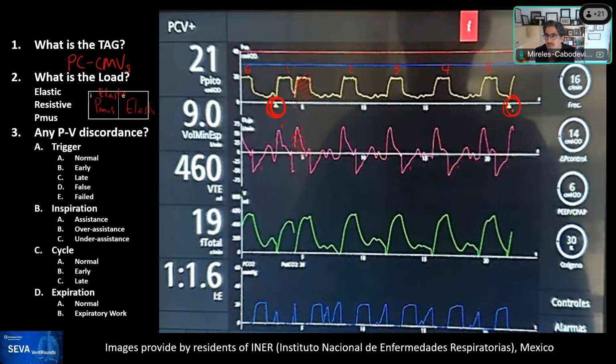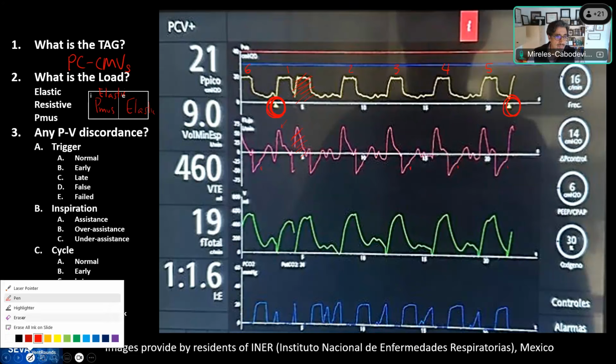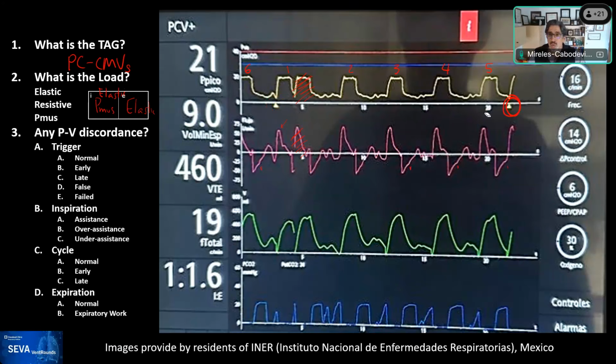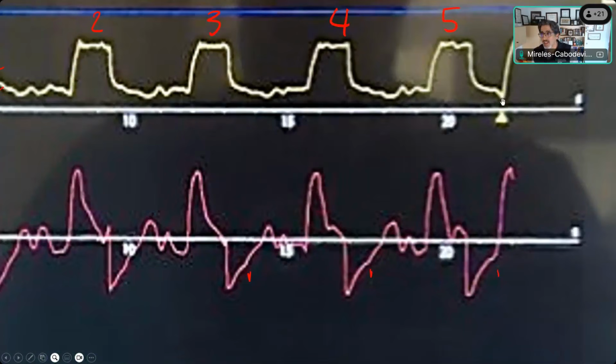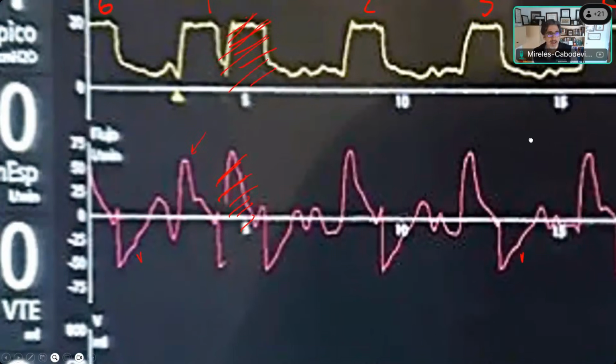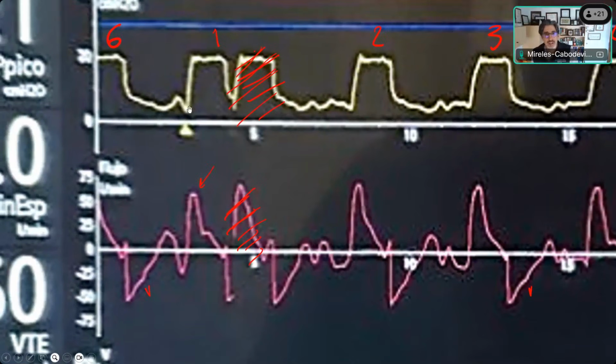And we know that because of the color, yellow or whitish or off-white, egg white, whatever is in trend these days. And so there's two breaths that are patient triggered. And actually, for the luck of you, we can see the little divot. You see that? On breath number 1, there seems to be a divot. In breath number 2 and 3, you could argue that there's a divot. On 4, there's none. But these are marked and the ventilator picked up on them, correct?